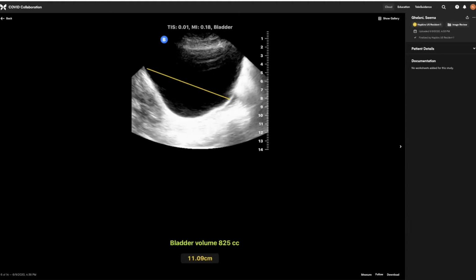I have to say I've researched this at a number of different points in my ultrasound academic career, and there is no clear consensus. The AIUM has no guidelines about which way to measure. There's not really anything good in the traditional radiology literature, and even if you go to some of the bigger textbooks, you'll see variation in the way that this is taught. So I don't know that there's a really concrete definitive answer on how to perform that measurement.